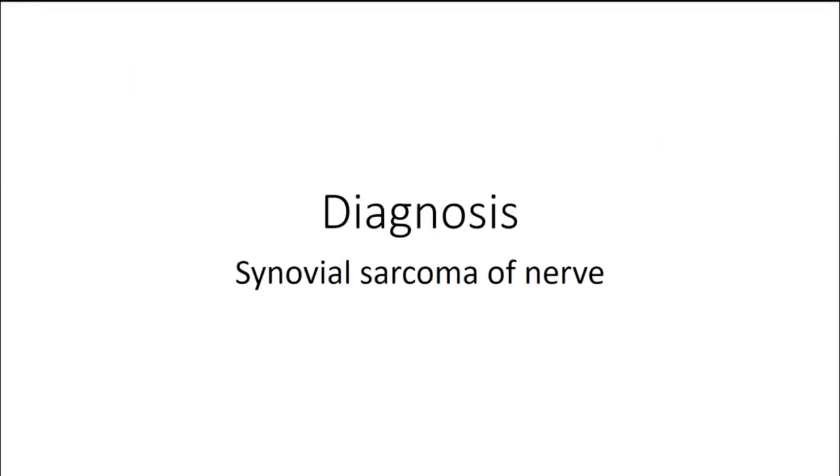And this is actually a synovial sarcoma. It's really the main differential diagnosis with MPNST. They look very similar. They can have a similar immunohistochemical profile. Synovial sarcoma can have some S100. MPNSTs can have some keratin. So there's a lot of overlap in the phenotype. This one actually was confirmed by genetic means. The synovial sarcoma fusions are not compatible with a diagnosis of MPNST.